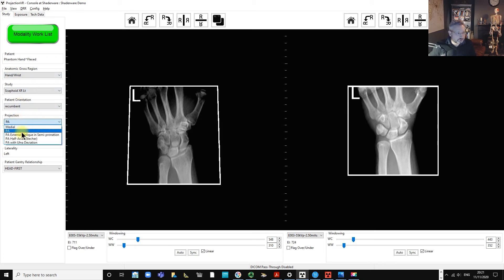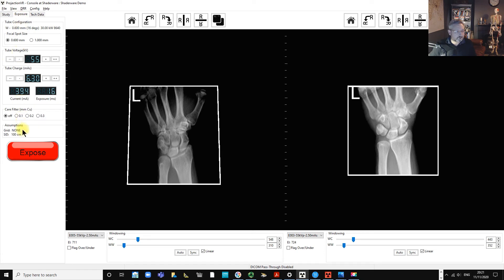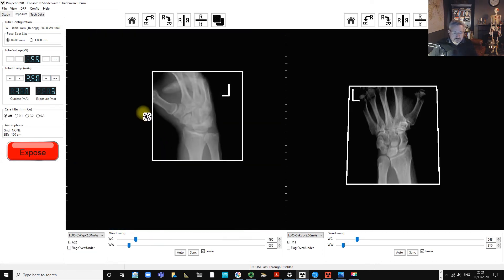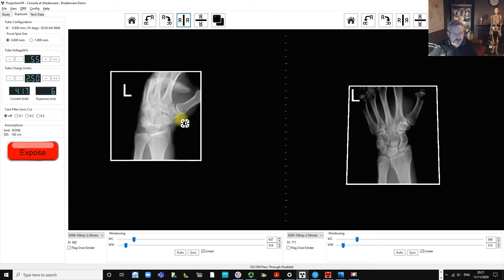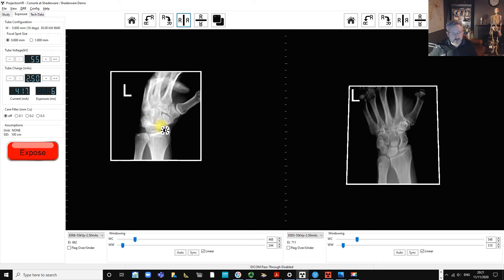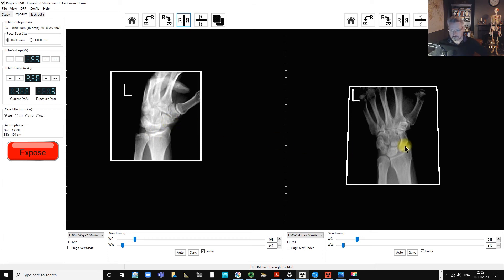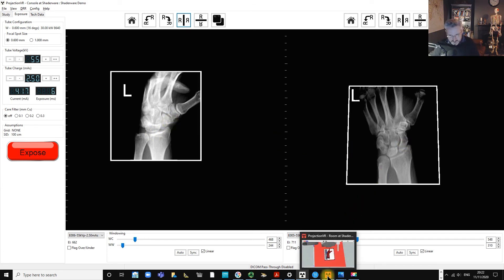We'll call this the oblique and drop the exposure down to 2.5. The oblique is good for seeing the lunate — you can see its nice cup shape — and the capitate sitting in the lunate. We can also see the distal pole of the scaphoid quite nicely in this oblique, along with the trapezium, trapezoid, and first metacarpal. Quite nice images showing a different part of the scaphoid.